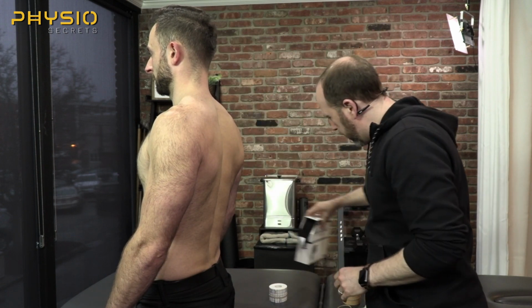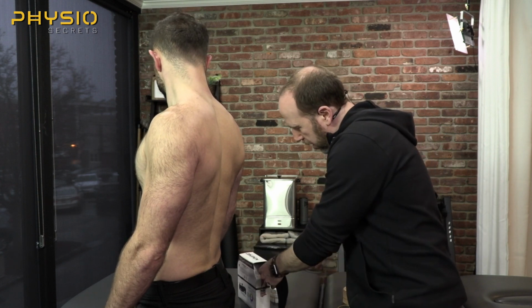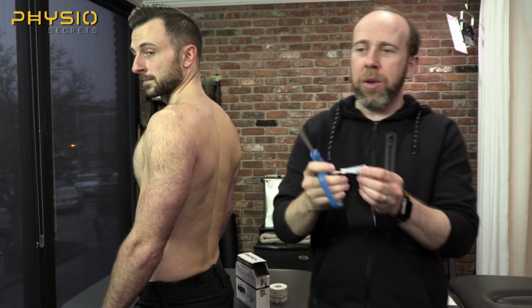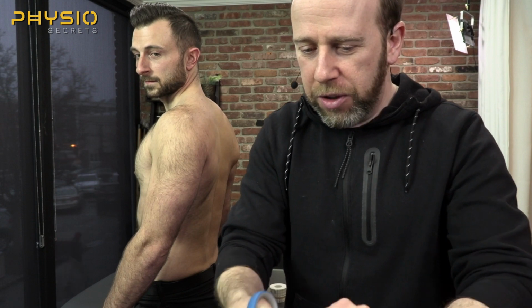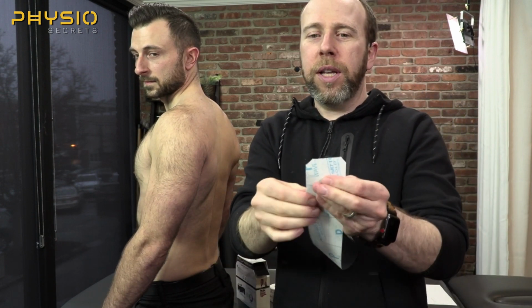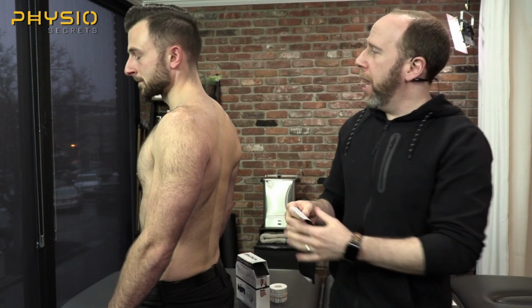Now, you know what? Let's do this. I'm going to K-tape you first and see what that feels like to you. So when I do K-tape, by the way, guys, I don't round the edges. I find that to be terribly annoying. I'll show you what I do instead, is I just cut the corners like this. Essentially just cut the edges. It does exactly the same thing. Okay, so let's K-tape them.